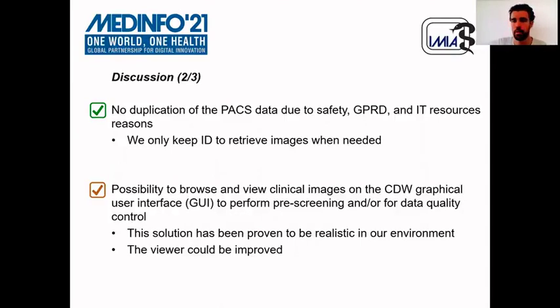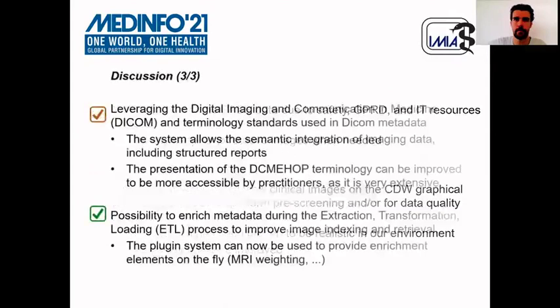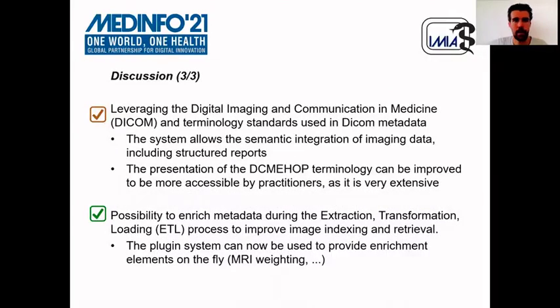And the possibility to browse and view clinical images comes with the full integration of imaging data into EHOP, but the viewer could be improved. The semantic integration allows us to query on any DICOM attribute anywhere in a DICOM document. But as we've seen, the DCM EHOP terminology is very extensive, and it could be improved to be easier to use for clinicians.